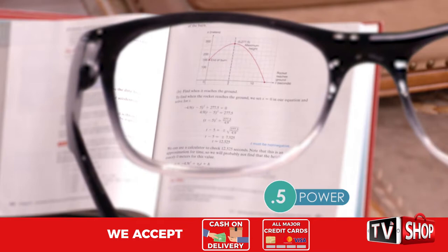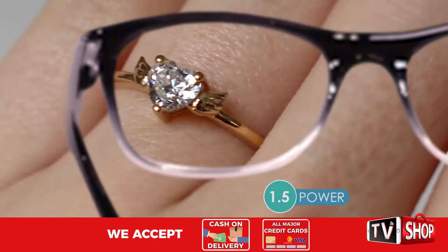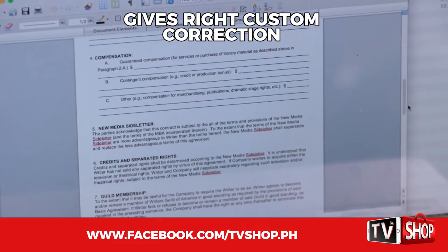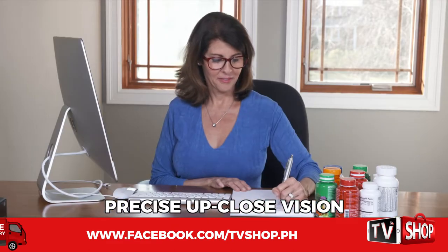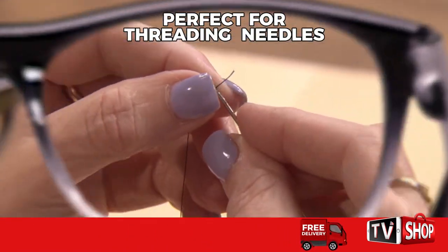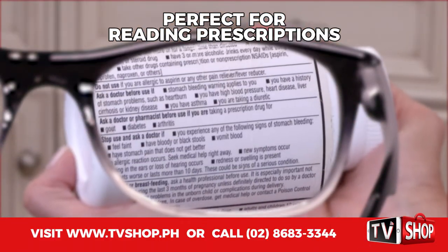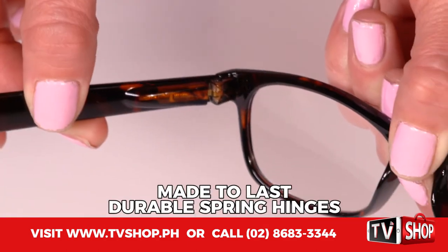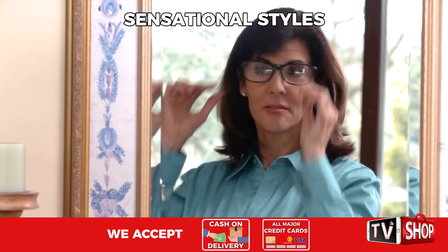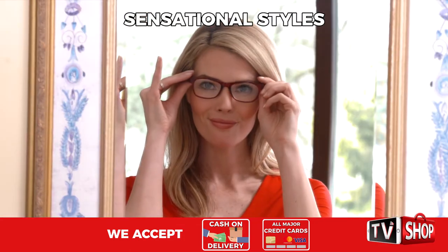Whether you need 0.5 power, 2.75 power, or somewhere in between, One Power Readers give you a just-right custom correction for precise, up-close vision. You can even wear them over your contacts. They're perfect for threading a needle or reading directions on prescriptions and vitamin bottles. They're made to last with durable spring hinges. One Power Readers come in sensational styles, from everyday classy to fashion-wear chic.